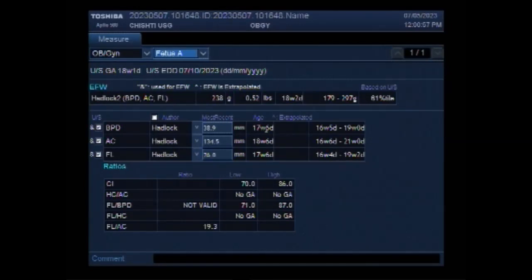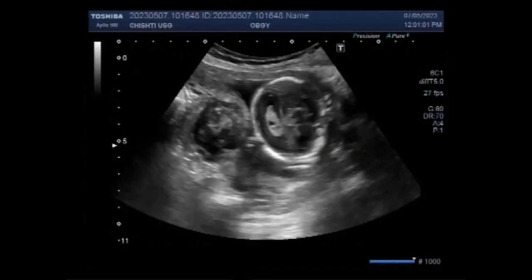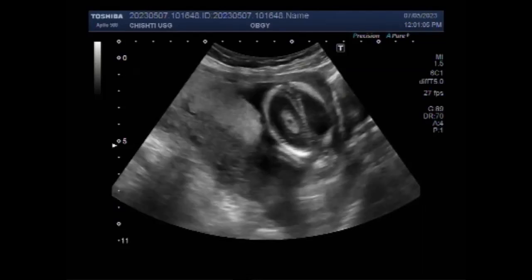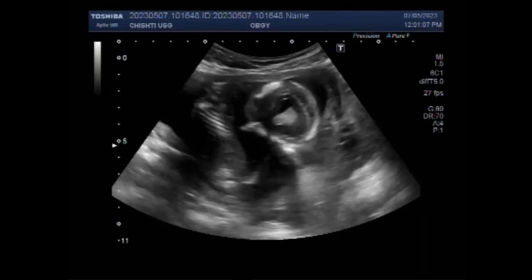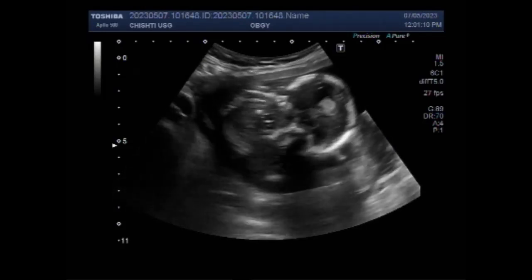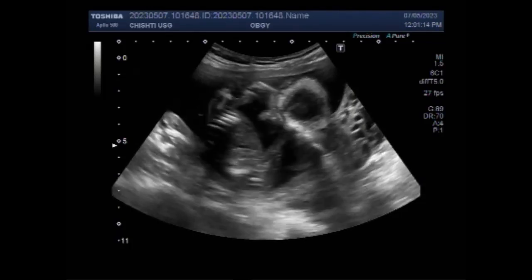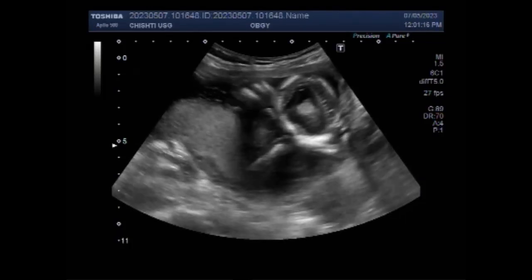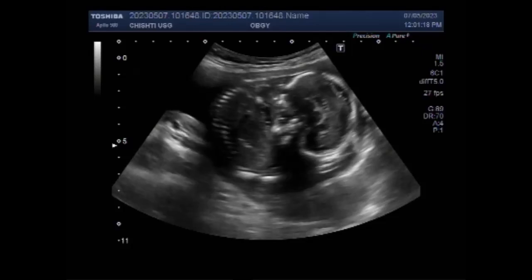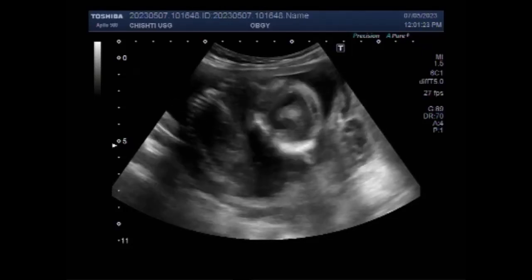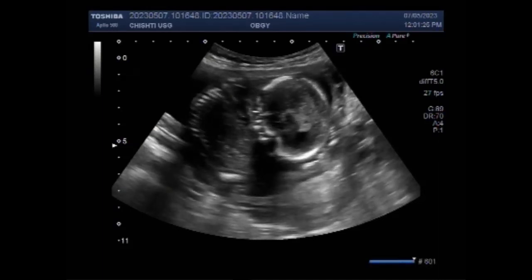An ovarian mass or ovarian tumor is a slow-growing abnormal mass of tissue on or in the woman's ovary. A tumor is a solid mass, unlike a fluid-filled ovarian cyst. A tumor can be benign or cancerous, i.e. malignant, but ovarian tumors are typically benign. You can see the fetus is morphologically normal but has a transverse lie with breech presentation.